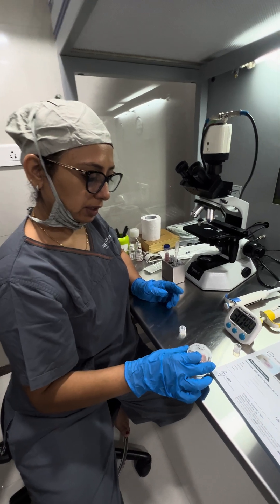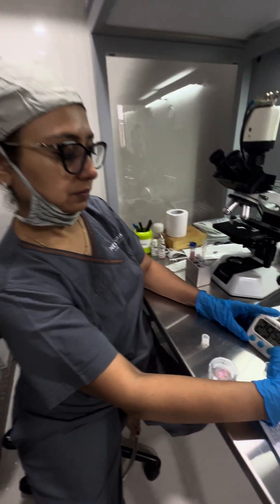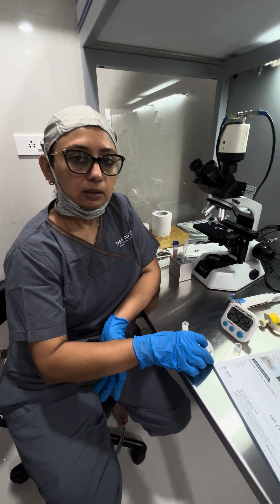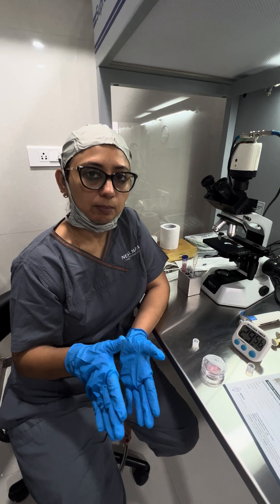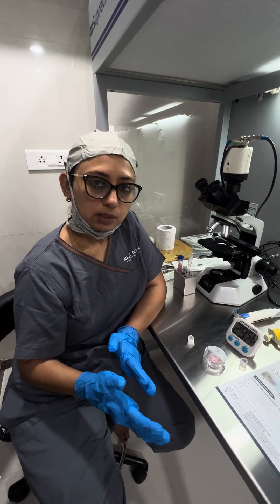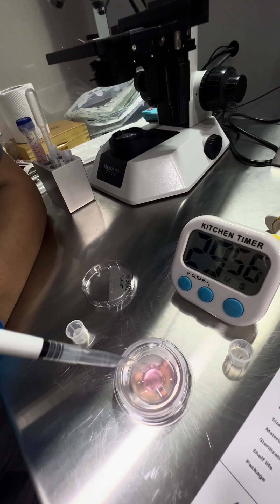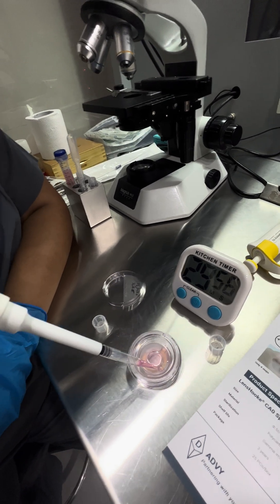Now we will incubate it for 30 minutes. Incubation is mandatory for 30 minutes, but incubation at 37°C is not mandatory. If you are using it for IUI, you can keep it at room temperature for 30 minutes. After 30 minutes, we will retrieve the sperm from this groove — like this — we will retrieve the sperm.